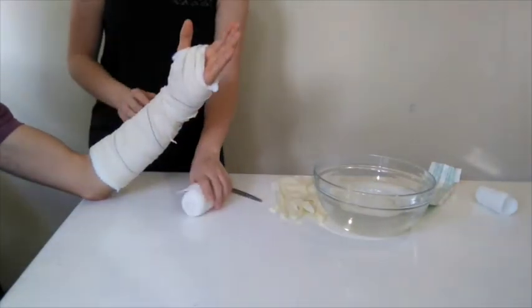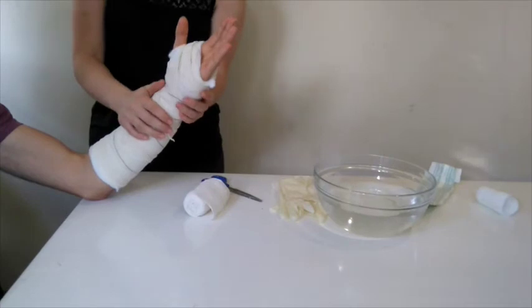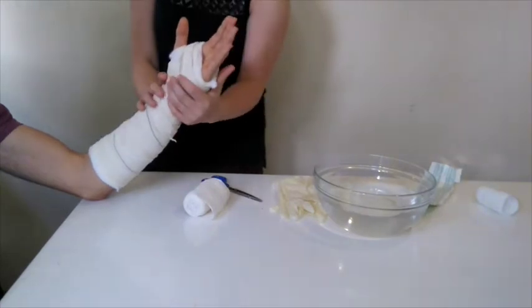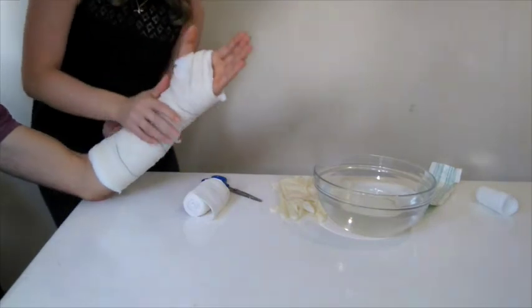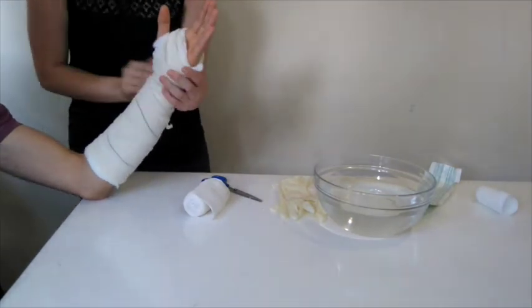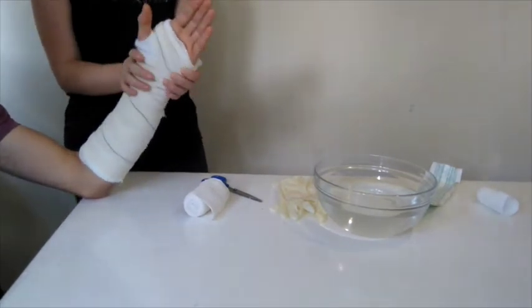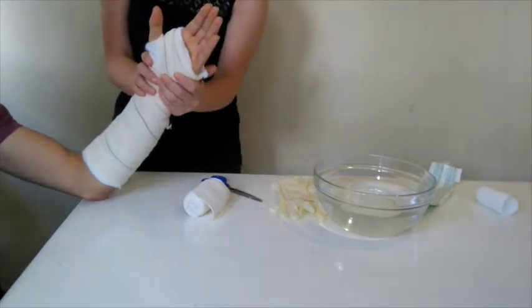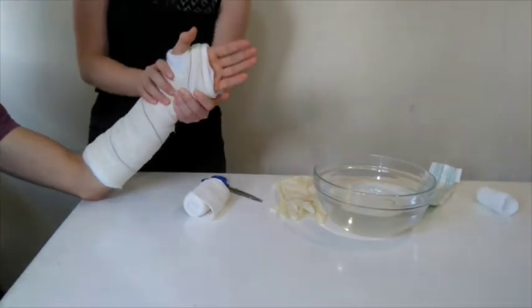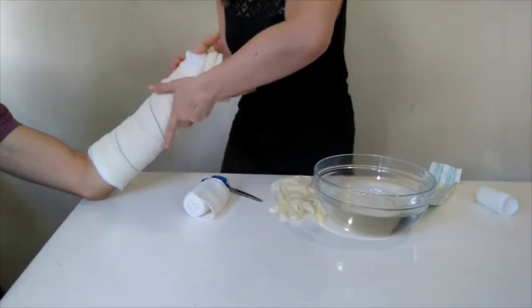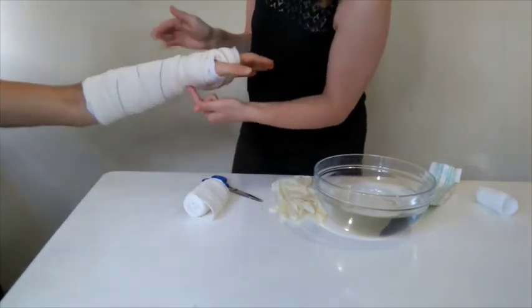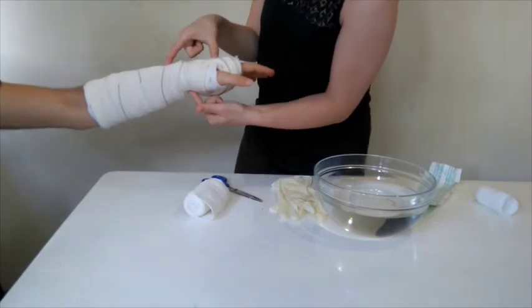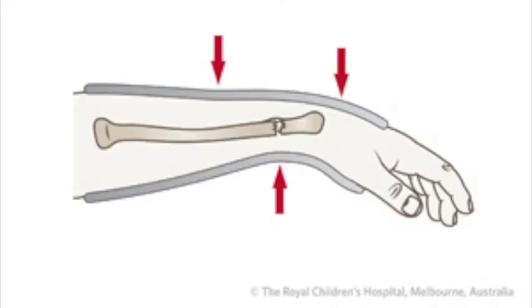It is advisable to start moulding the cast after the second layer of plaster of Paris. The layers must be smoothed and moulded to give it strength and maximise the fit around the wrist. Moulding is done using the palms of the hand, not the fingers, as this may cause indentation and could result in pressure sores. Ultimately, the cast should be oblong and not cylindrical, as this will give the greatest amount of support. After smoothing, apply three-point pressure over the fracture to mould it and stabilise the reduction, as shown in the pictures.